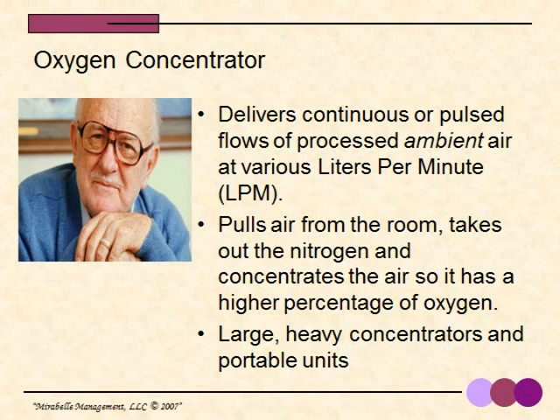There are small portable oxygen concentrators that produce less than 1 liter per minute of oxygen and use some version of either pulse flow or demand flow to deliver oxygen only when the person is inhaling. These portable concentrators typically plug into a wall outlet like the larger, heavier stationary concentrators.